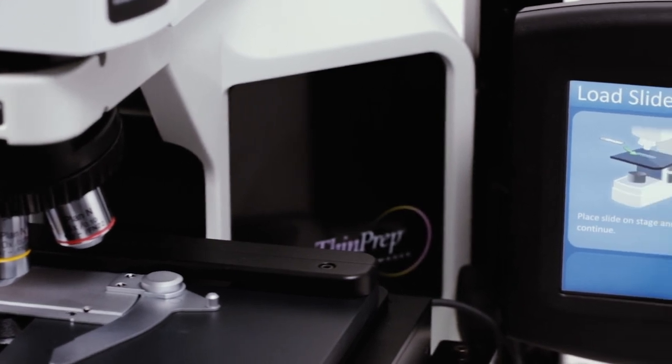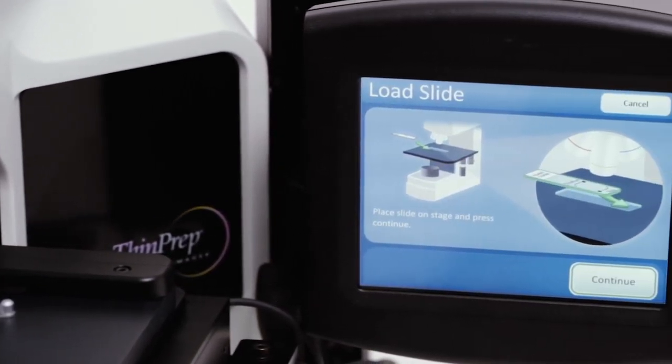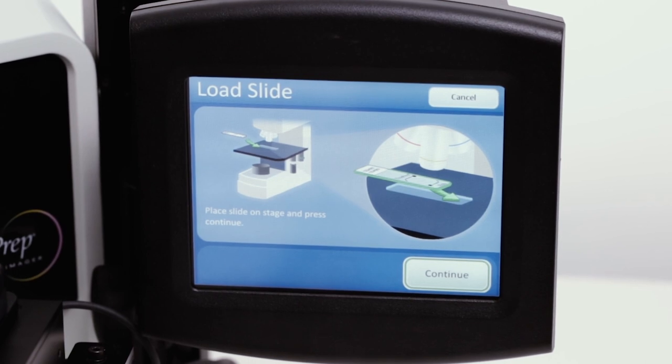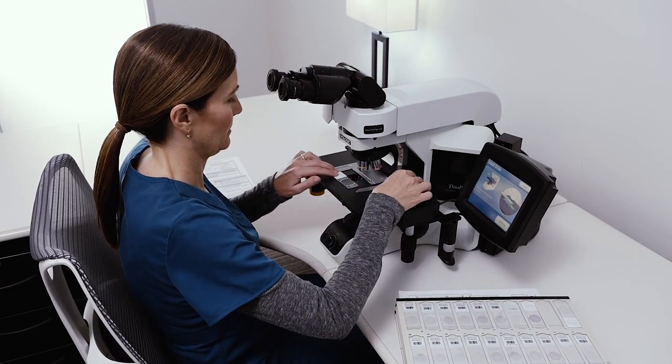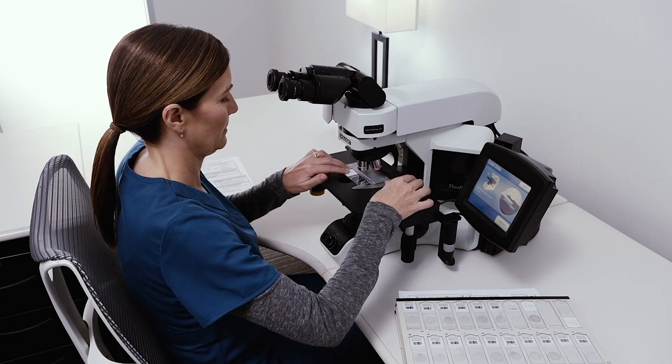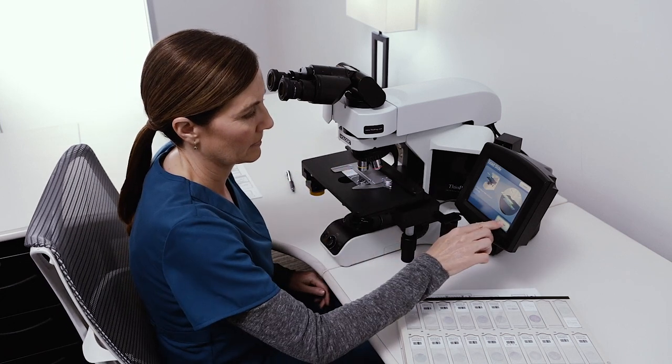The ThinPrep Integrated Imager features an intuitive touchscreen that guides the user through the imaging and review process. Once a slide is placed on the stage, the imager reads the slide ID to ensure that the unique ID is captured in the imaging database.